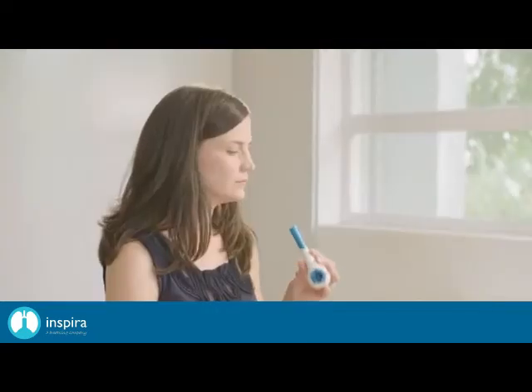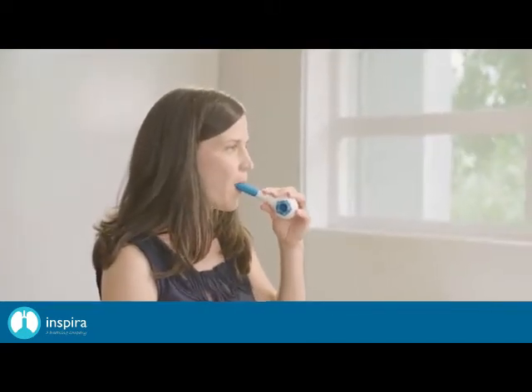Okay, it's your turn to try. Put the mouthpiece in your mouth. Okay, try not to clench it with your teeth. I don't want you to tense up your jaw. I want you to take a deep breath in through the mouthpiece, hold, and then breathe out. Did you hear the wind sound?